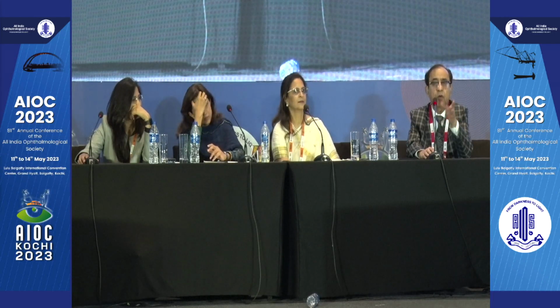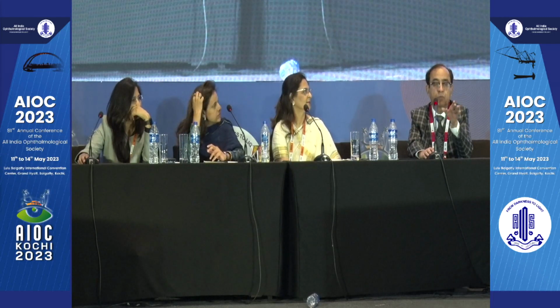But if I can make a 5 millimeter rhexis without breaking a synechia, I will not break the synechia, because I don't want them to become floppy. Like in pseudoexfoliation cases, I do not separate the capsule from the iris. If I is good enough, say 5 millimeter rhexis, I can do 4.5 millimeter. I'll rather finish off this surgery, because if I separate and try to enlarge, the iris becomes floppy.